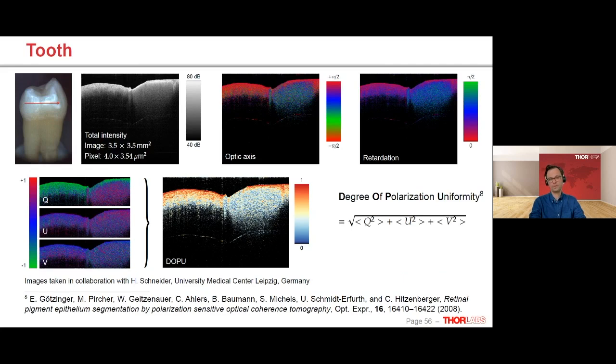And because we have a certain resolution here with our system, we only capture from that region of space, inside of the PSF, one particular polarization. And for the tooth here, I assume it's really this sponge-like structure that the caries leaves behind that scrambles the polarization state on tiny length scales. So it's really what the degree of polarization uniformity picks up here.